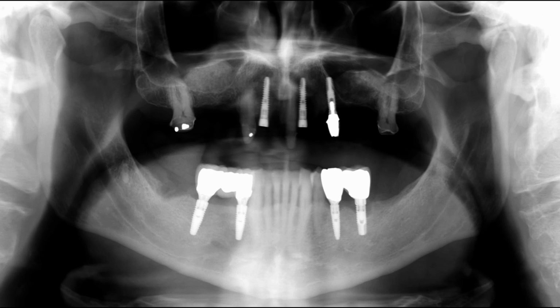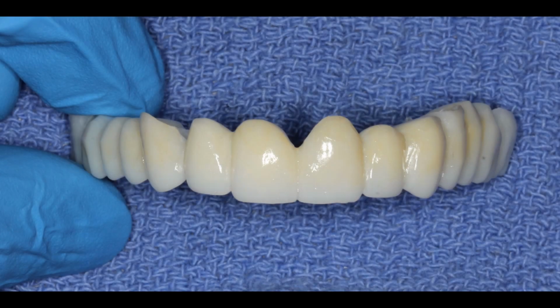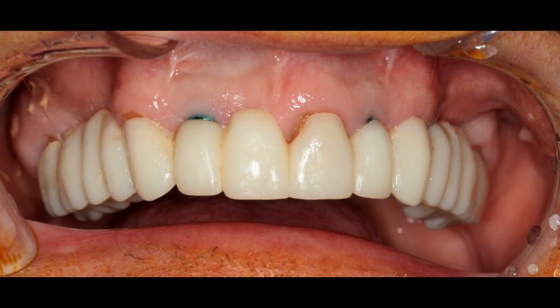His first fixed temporary that went on 4 teeth and 1 implant looks like this. Same design though. Here he is after he returns 8 months after that original surgery.